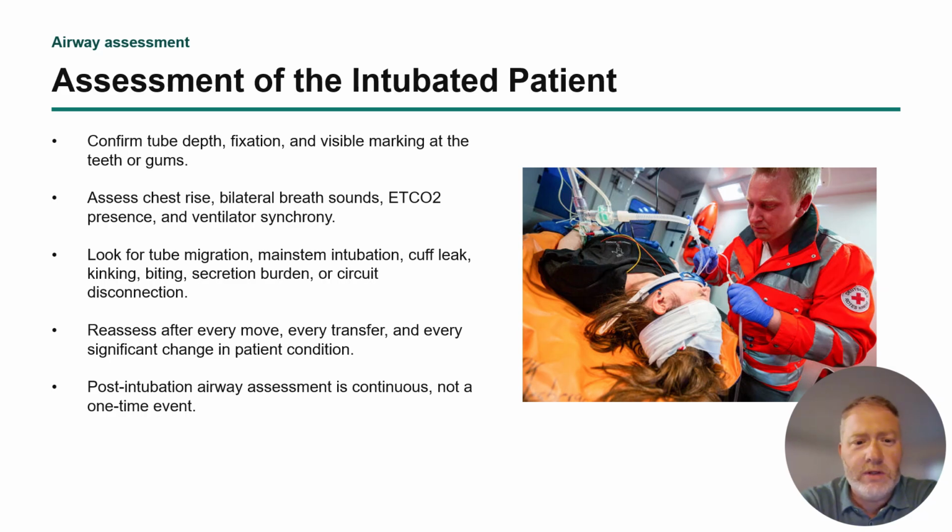Moving on to the assessment of the intubated patient, many things that we do routinely immediately upon intubating a patient. And I mean, you guys are well versed in the process of intubation and securing the tube. So again, this is going to be pretty surface level review type stuff, but confirming the tube depth.